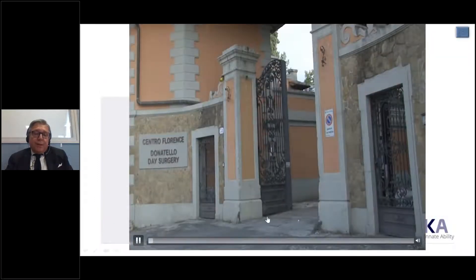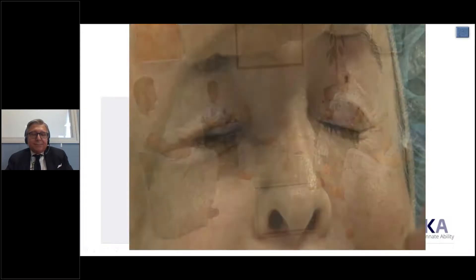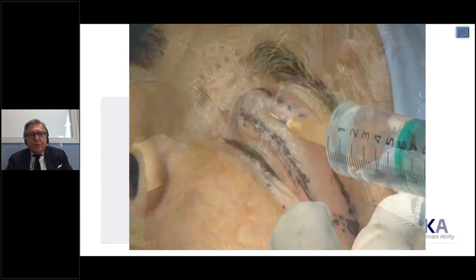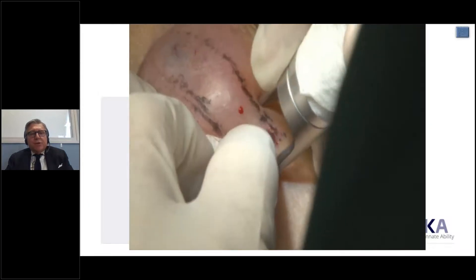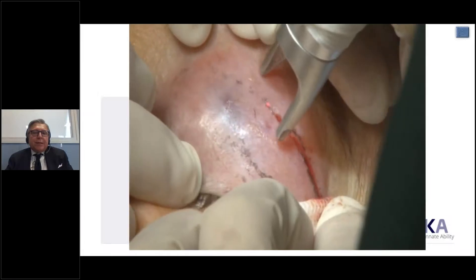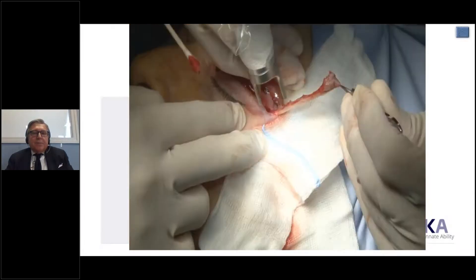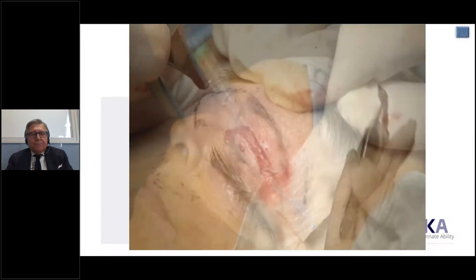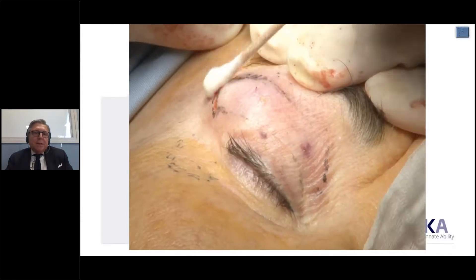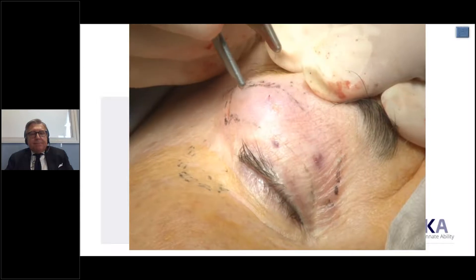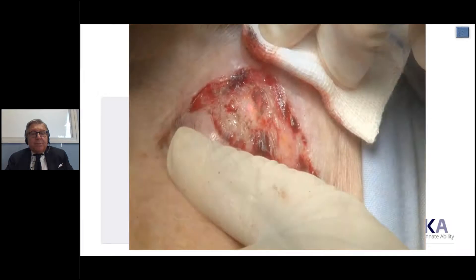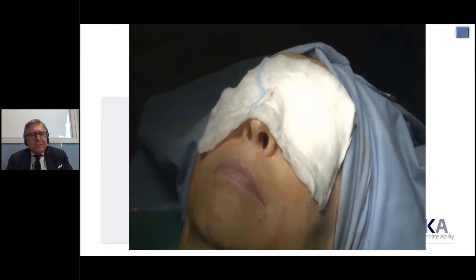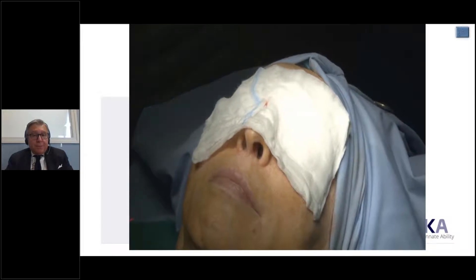This video shows our operating room. The preoperative procedure is the same as traditional knife surgery. For upper blepharoplasty, we apply local anesthesia and cut along the pre-marked lines. The incision is perfect with modest bleeding. After this, we remove the excised lozenge. The incision is very delicate. We see no visible scarring after 20 days, one month, or even one year. Standard stitches are placed as usual.